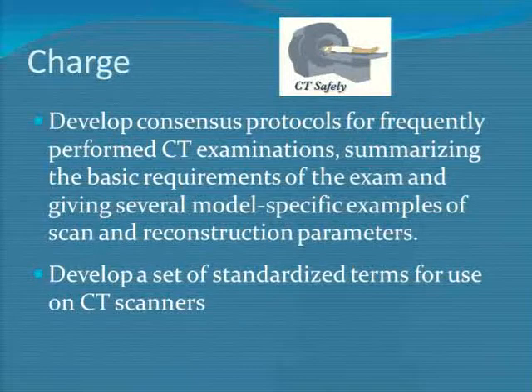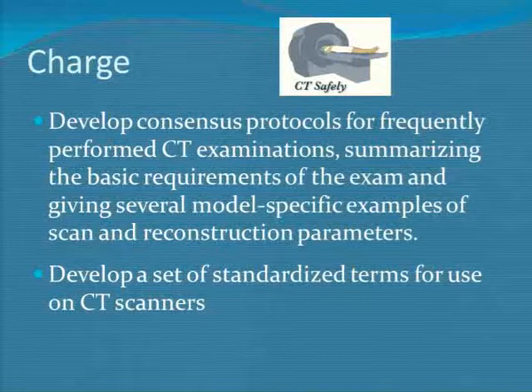The other thing we are charged with doing is developing a set of standardized terms for use on CT scanners. We've all been faced with this. The vendors all use different words for the same darn thing, and it confuses the heck out of everybody, from the technologist to the physicist to the radiologist. This is more of a long-term goal.